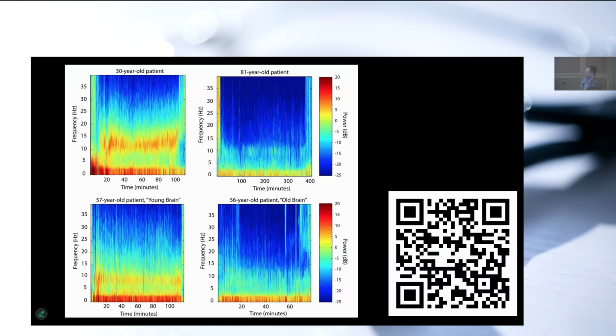And if you take this group of patients and you stratify them based on their alpha band, you again can predict intraoperative burst suppression, and you can predict robustly the incidence of postoperative delirium. So this is harkening back to those 1950s days. This is giving us more information than we have at our availability by simply looking at the chart and examining the patient and guessing about their risk.